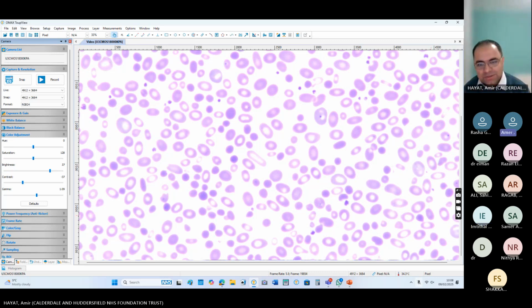You say this is elliptocytosis, but what about these spherocytes? Think about these spherocytes. There are so many. Maybe transfused. If they were transfused, there should be a lot of cells like this one, but there are only a few cells like it. Transfused cells should not have this many spherocytes. This slide is full of poikilocytes.